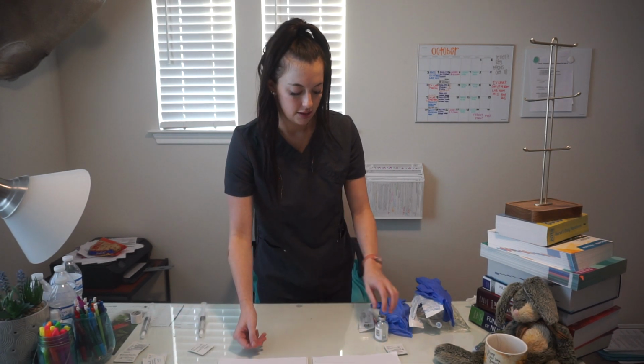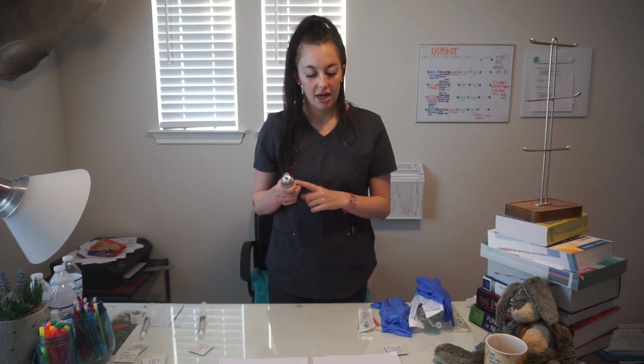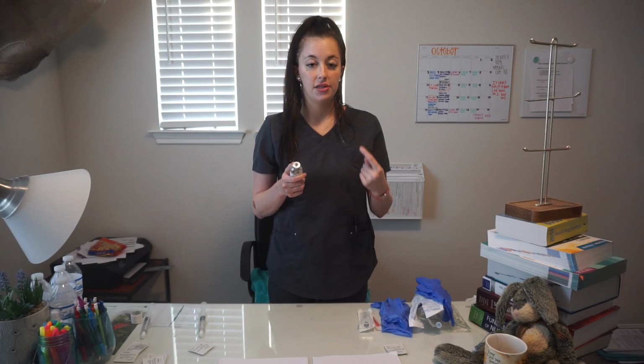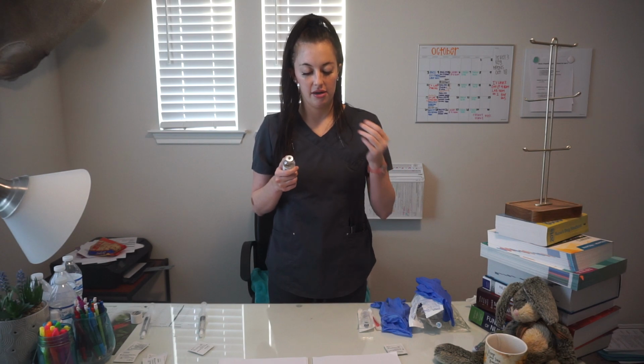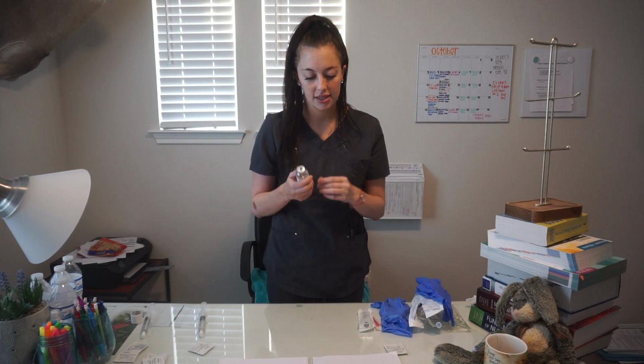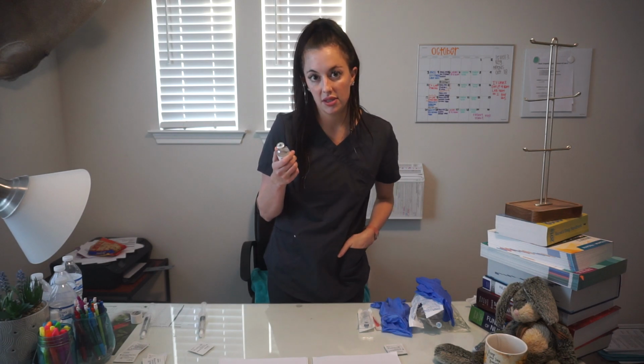Okay, so I have labetalol, 20 milligrams. I'm going to push 4 milliliters into his PICC line over 2 minutes. It's an alpha beta blocker. It controls blood pressure.